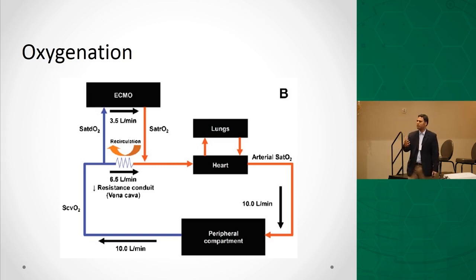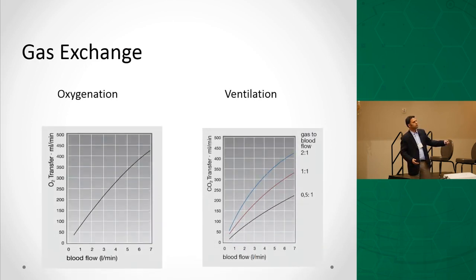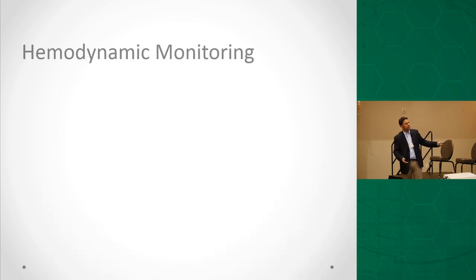Sometimes, and I'm not saying that we should do it all the time, if your patient is anxious for some reason, your heart rate increases, then automatically your cardiac output goes up, right? So if you determine this is not sepsis, this is not infection, and this may be just an increase in the heart rate for some reason, if it's fevers, you control the fevers. If you don't understand what's going on, people have even used beta blockers to reduce the heart rate so that you could capture more and more of the cardiac output. Because really, it's impossible to go to 6 or 7 or 8 liters of flow on ECMO easily. It's unheard of. It cannot be done, unfortunately. All right, this is the same thing again. We'll skip this slide.